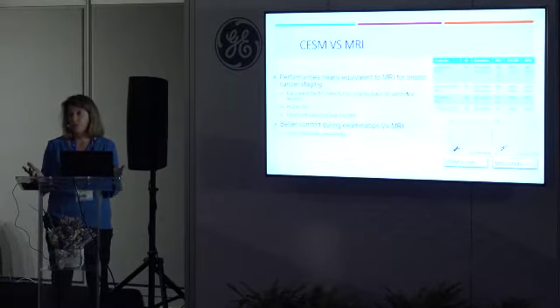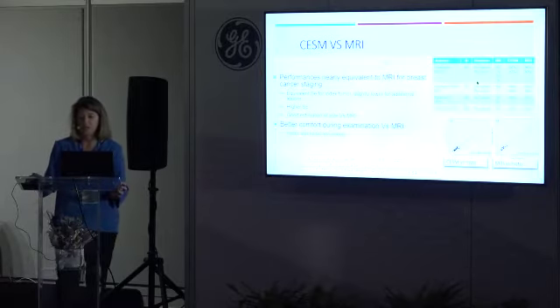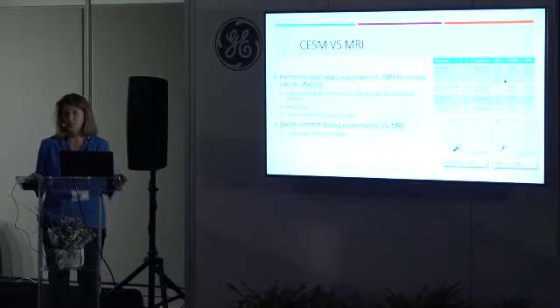But now the interest is to compare with MRI, because contrast mammography is a technique with iodine injection. Of course, it's very important to compare with MRI. So if we compare contrast mammography and MRI, some papers have also been published. We are nearly at the same sensitivity as MRI for the index lesion, slightly lower for detection of small additional malignant lesions, but the good point is a higher specificity, because we don't have so many additional benign foci or benign glandular tissue, which are very disturbing in MRI. Maybe because of the lower sensitivity of iodine also, but when you combine sensitivity and specificity, we obtain better accuracy with contrast mammography in comparison with MRI.